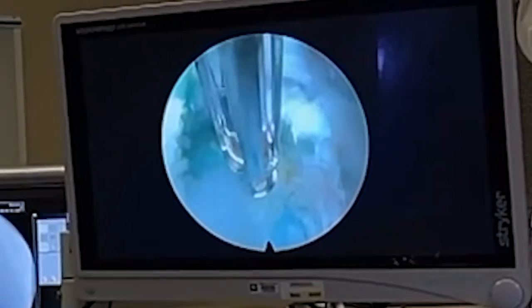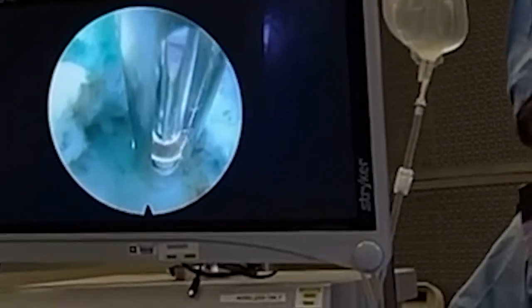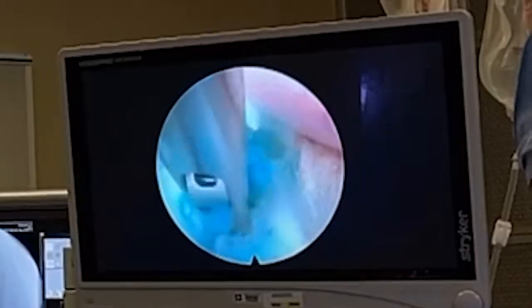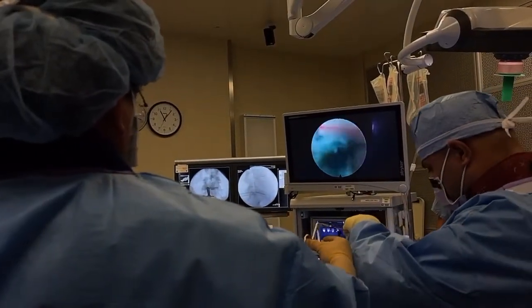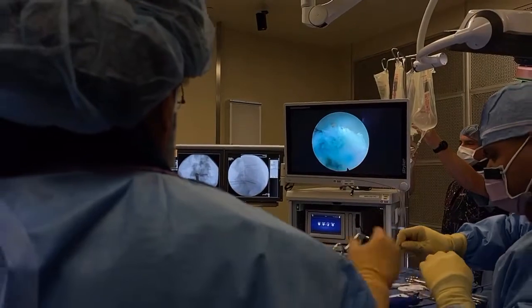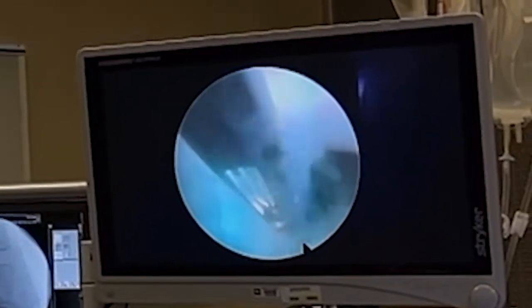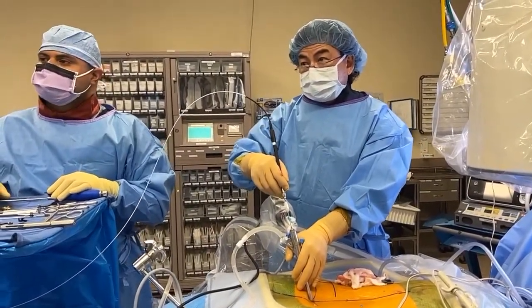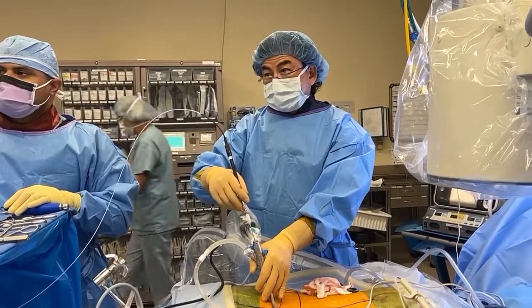You can see the tear, the white and then the blue. Oh, I don't know what to do with myself. Just love it when things are going right. Oh, that felt so good. My favorite tutorial now. There's the dural tube. Look away. My snaggle tooth. I love this thing. I'm so glad I have the laser today. Oh yes. Must remember to blink though.